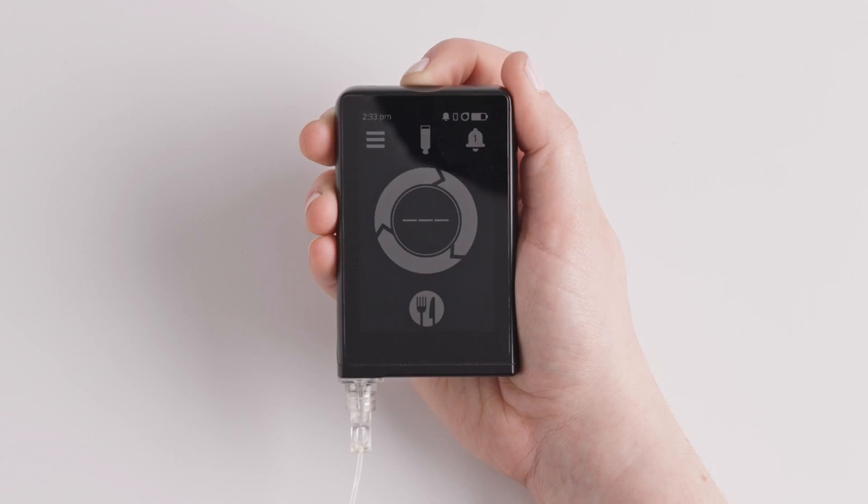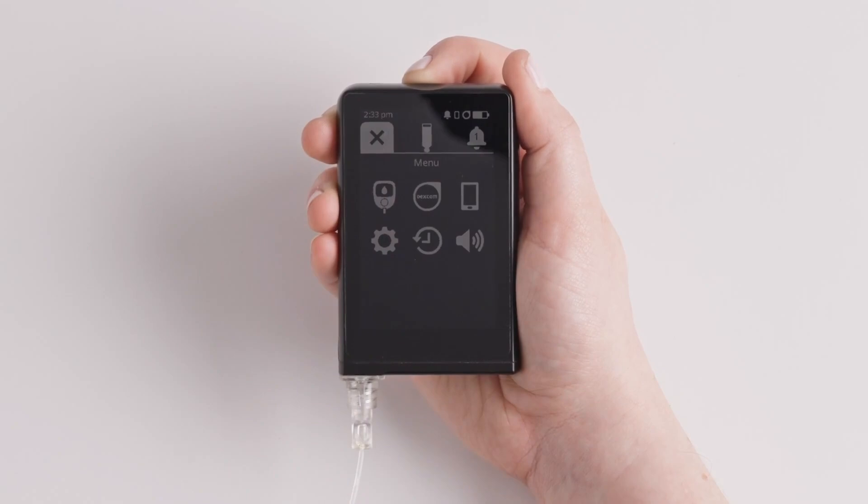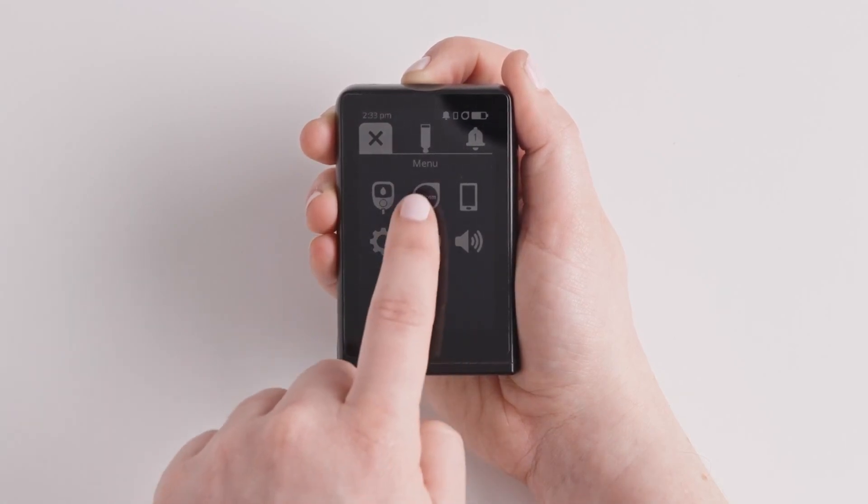From the home screen of your islet, tap the menu icon in the upper left corner. Tap the CGM icon in the middle of the first row.